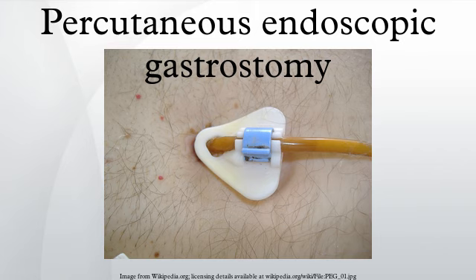A gastrostomy can be placed to decompress the stomach contents in a patient with a malignant bowel obstruction. This is referred to as a venting PEG, and is placed to prevent and manage nausea and vomiting. A gastrostomy can also be used to treat volvulus of the stomach, where the stomach twists along one of its axes. The tube is used for gastropexy, or adhering the stomach to the abdominal wall, preventing twisting of the stomach. A PEG tube can be used in providing gastric or post-surgical drainage.